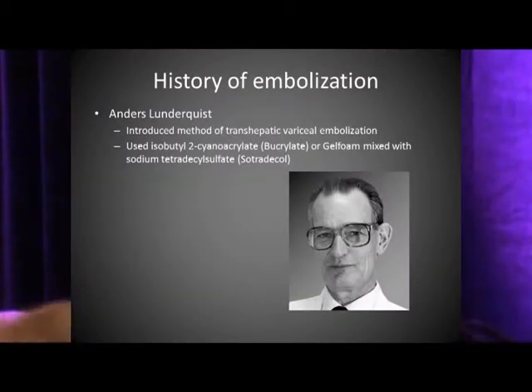This further progressed to Dr. Lunderquist, who in the early 70s, kind of late 70s, was doing transhepatic variceal embolization using a sclerosing agent, either alone or with gel foam. And then this has kind of progressed into what we do today.